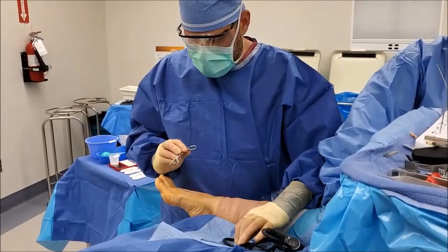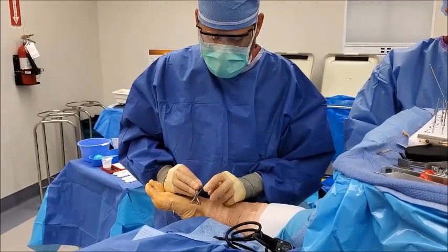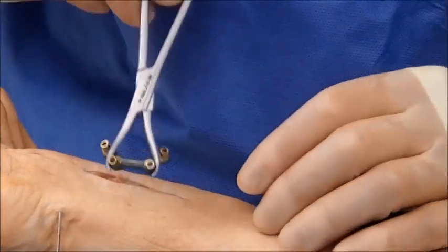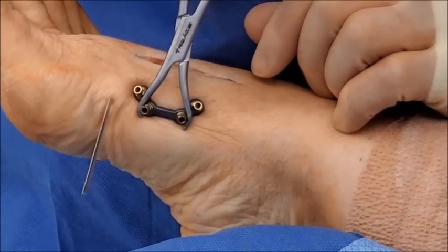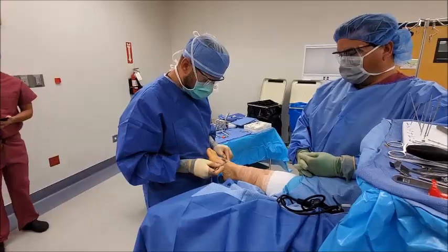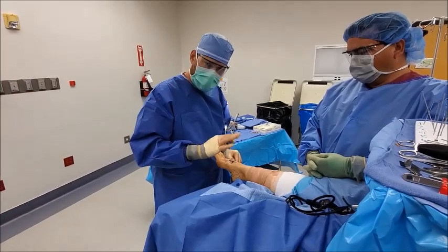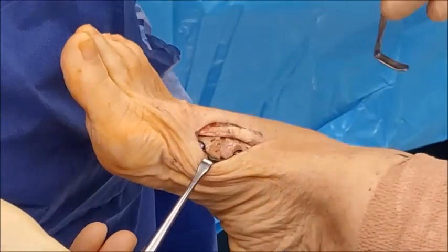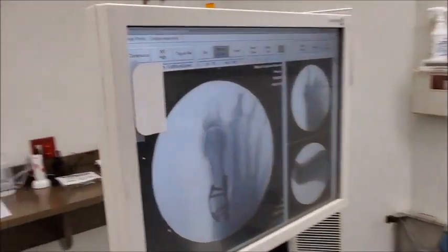Another great advantage of this minimal incision system is the power plantar plate. This allows us to get two screws lower on the metatarsal, closer to the weight-bearing surface, and because it's shorter we're able to use the smaller incision. It's placed on the side of the first tarsometatarsal joint. We've also applied a dorsal plate on top to create stability, and the medial power plantar plate on the side — you can barely see it because of the mini incision, but that's the whole idea.